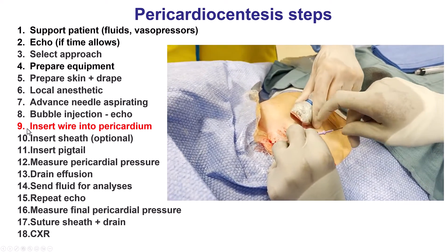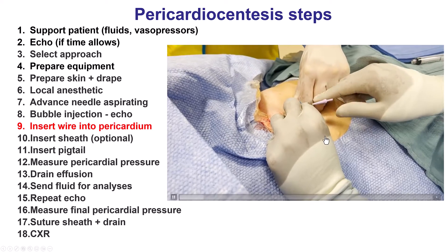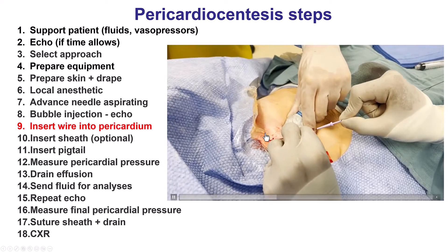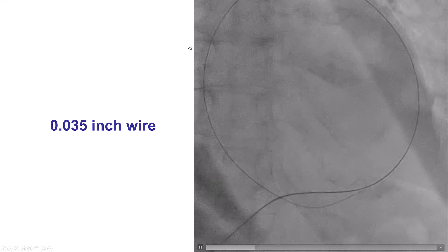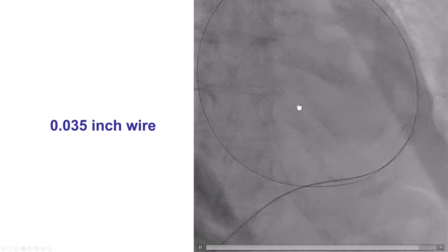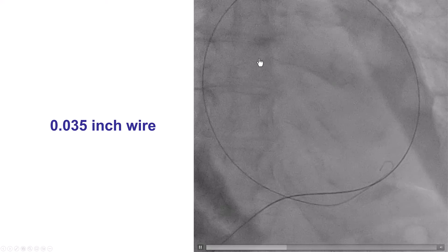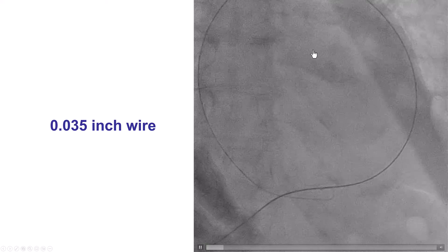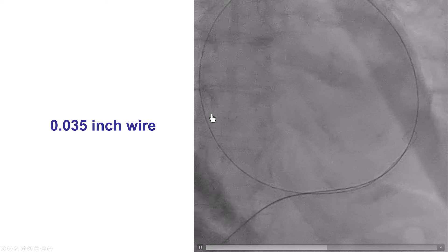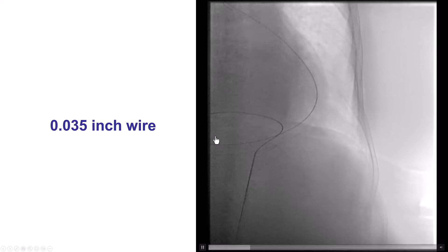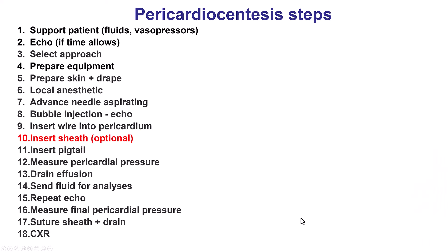Once we confirm we are in the pericardium, the next step is to advance a guide wire into the pericardial space. We check the position by fluoroscopy — the wire should wrap around the heart. If the wire appears to follow the course of blood vessels such as the pulmonary artery, that is a source of concern and the position should be re-confirmed.